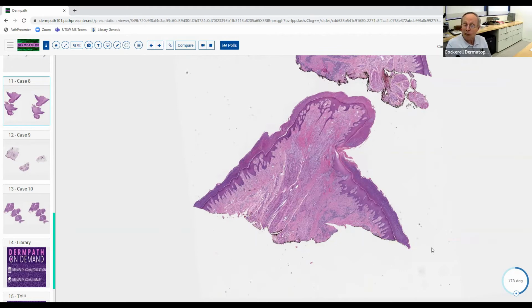And you're right, there's a lot of acanthosis. And what about the cornified layer? I don't know if we say it's from acral. Well, no, maybe not. Good. No. It is from acral skin. Excellent. So this is an acral biopsy. So this was probably sitting on somebody's hand, most likely.